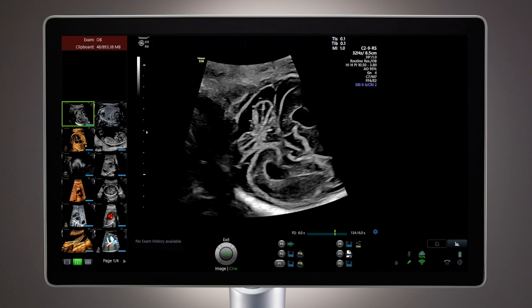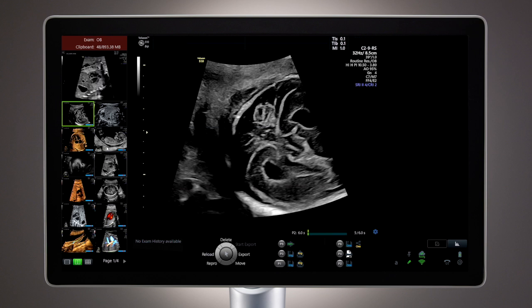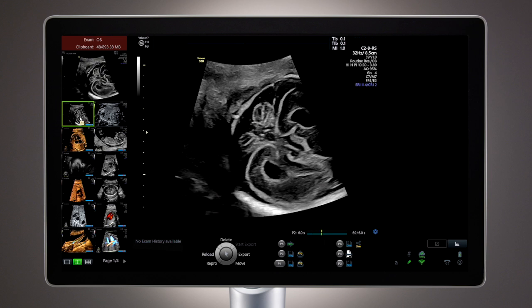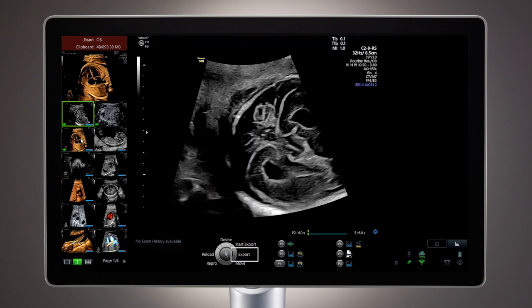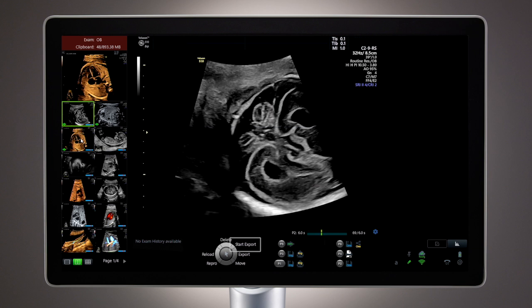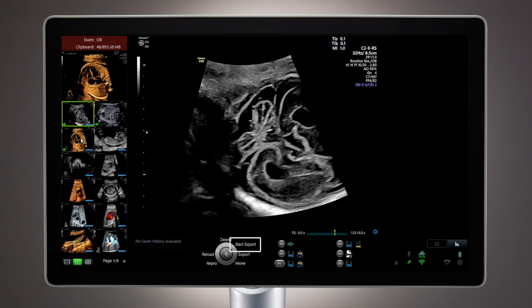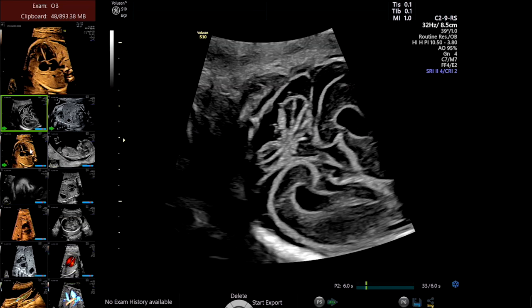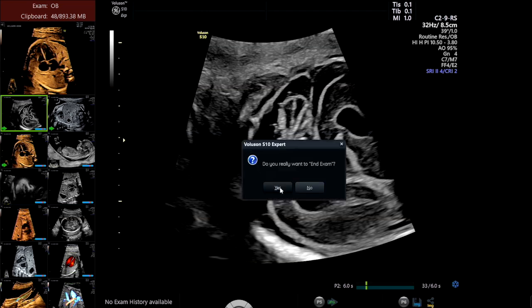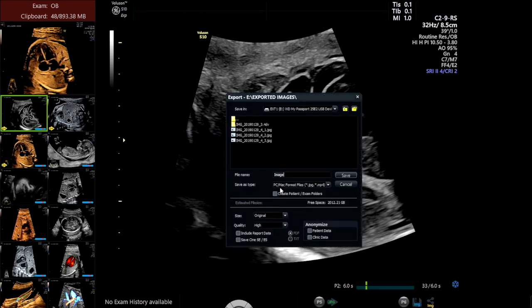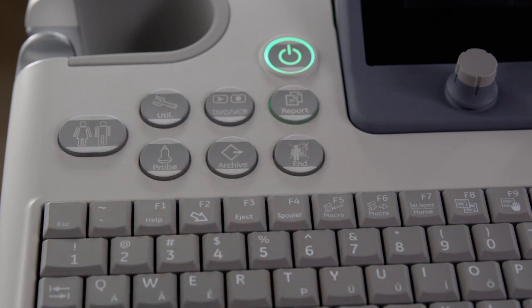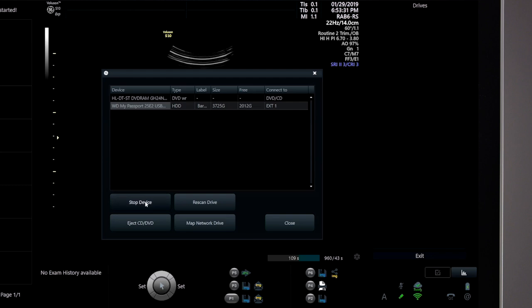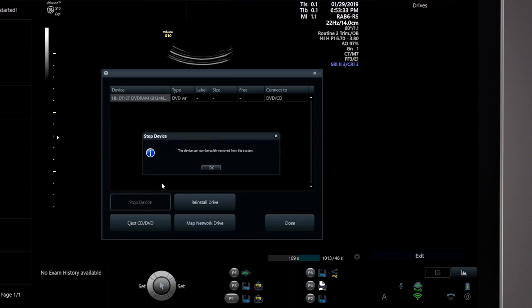Exporting can also be accomplished while the exam is active. During an exam, use the trackball and the right trackball key to select images to be exported. Export can be done immediately by selecting the Start Export key on the trackball. If images are not immediately exported, the system will automatically provide a prompt at End Exam to export selected images. When export is complete, select the Eject key on the alphanumeric keyboard and answer the on-screen dialog to eject the media.